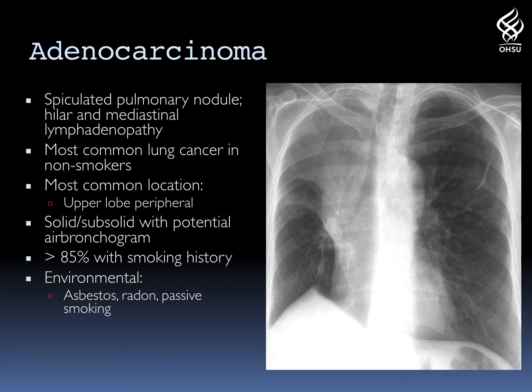This is a patient with known right upper lobe lung cancer. Notice the volume loss within the right hemithorax, the tenting of the right hemidiaphragm, and the loss of the right superior mediastinal contour. Also notice the inverted S-shaped contour of the inferior aspect of the upper lobe opacity, which is commonly described as the S-sign of Golden — a characteristic appearance of a right upper lobe lung cancer with resulting right upper lobe collapse.